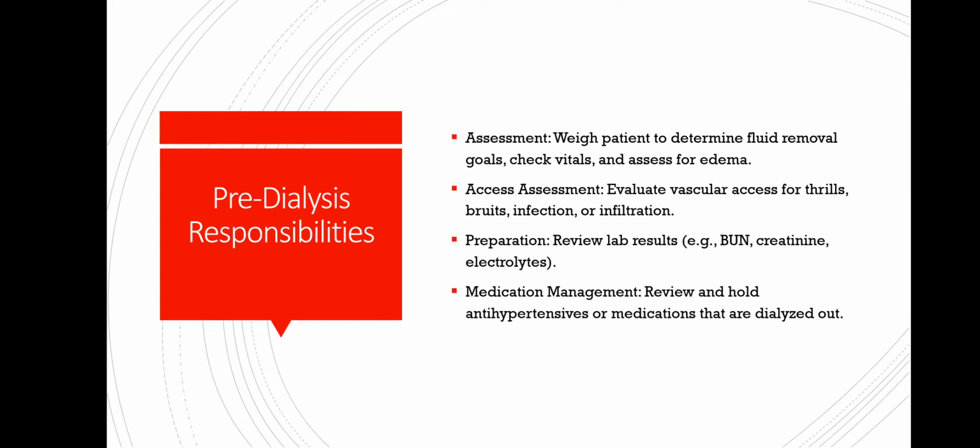Preparation: review lab results, for example BUN. BUN means blood urea nitrogen, creatinine and electrolytes. Medication management, it's to review and hold antihypertensives or medications that are dialyzed out.